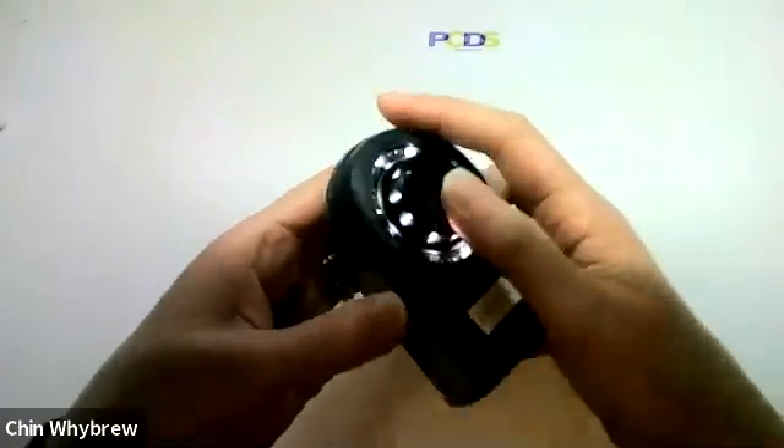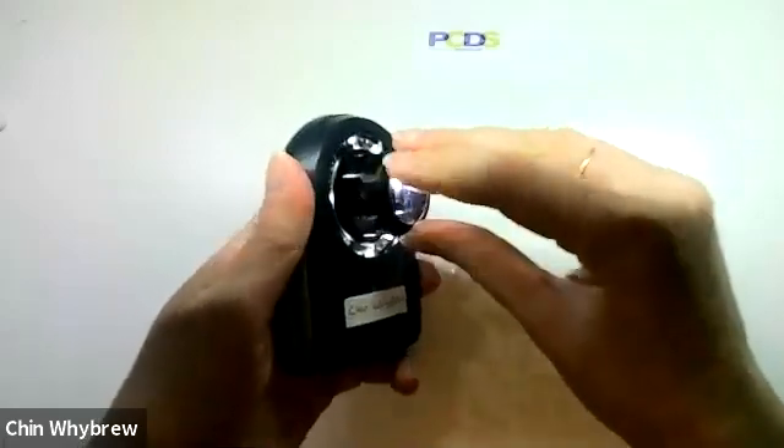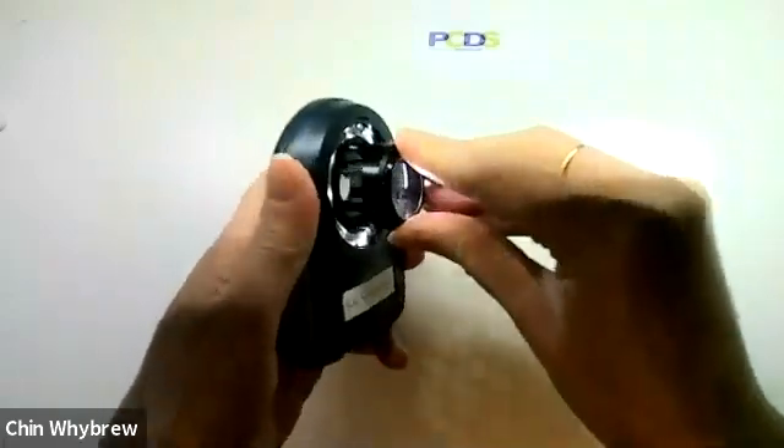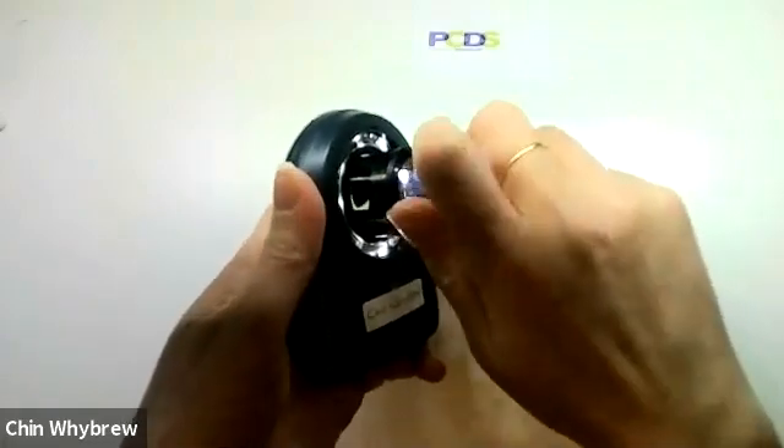My great top tip, if you do have one of these, is that when you screw it back on again — which is a bit fiddly — you don't screw it back on all the way. Don't put it too tight, otherwise it can be very difficult to get back off again.